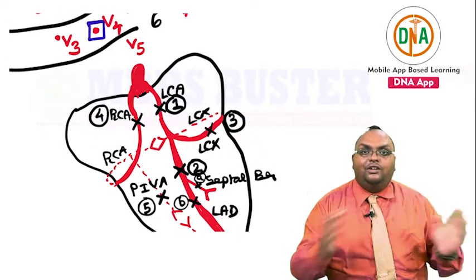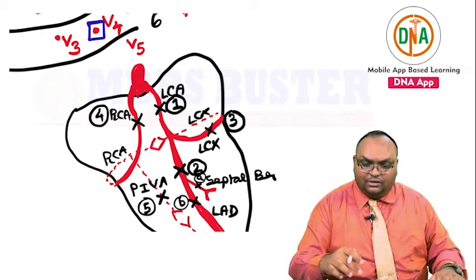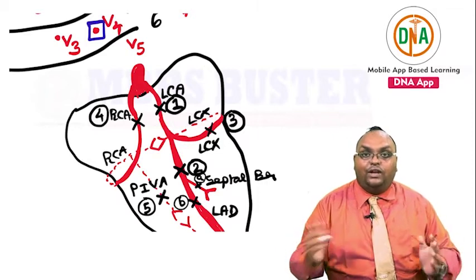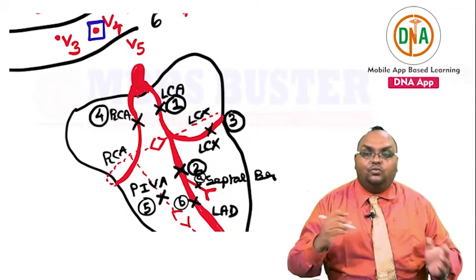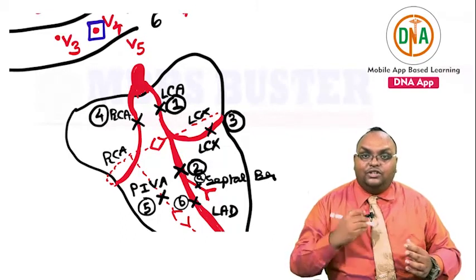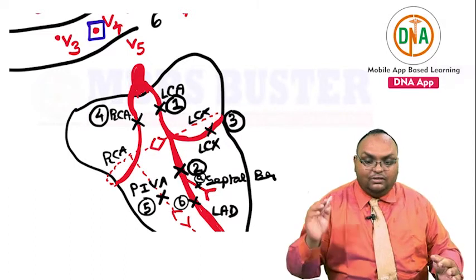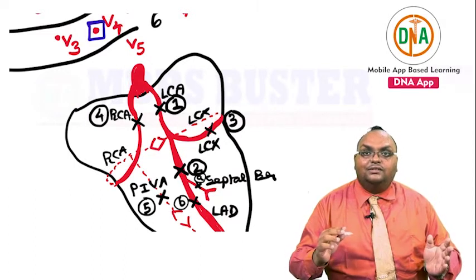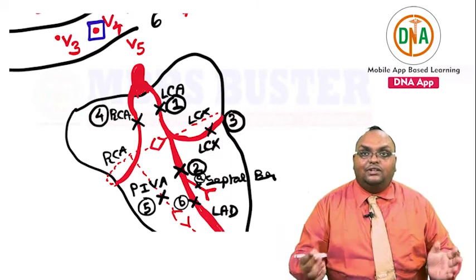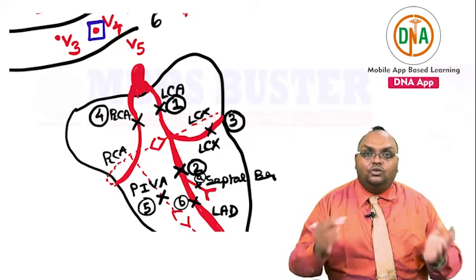1, left main coronary artery: 1, AVL, V1 to V6. 2, left anterior descending artery, before it gives off the septal branch: V1 to V4, 1, AVL. 2A, septal branch: 1, AVL, V1, V2. 2B, left anterior descending artery, after it has given off the septal branch: V3, V4, 1, AVL. 3, left circumflex coronary artery: V5, V6, 1, AVL, just the lateral surface. 4, right coronary artery proper, inferior wall: leads 2, 3, AVF.